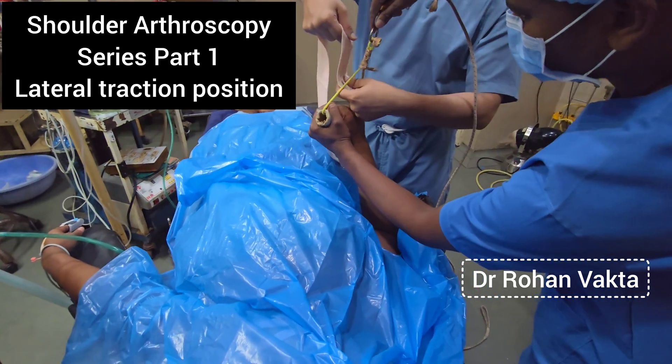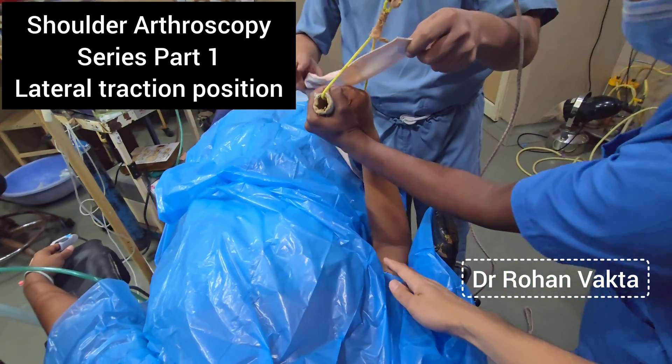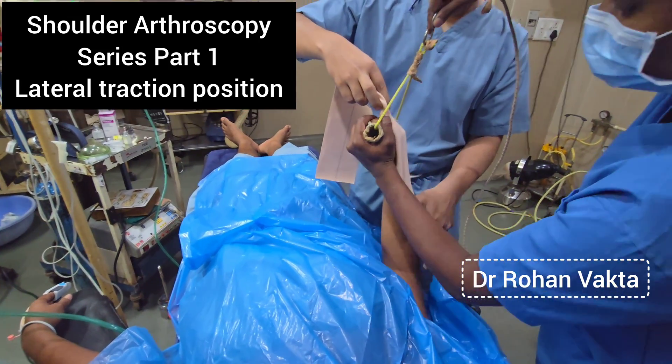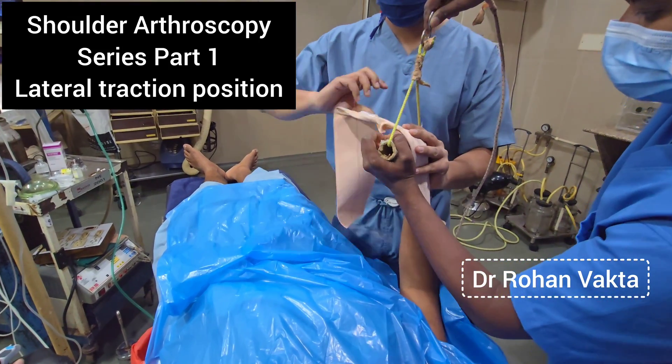You can take a normal plastic sheet, make a hole in it, and just pass it over the upper limb — just like an old drip. This is a normal hospital-made traction device that we will show you.